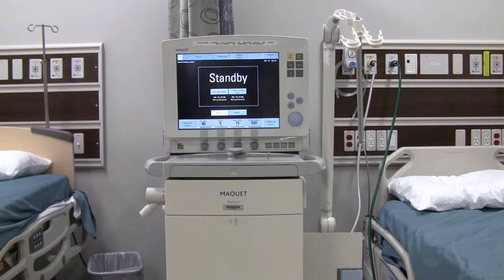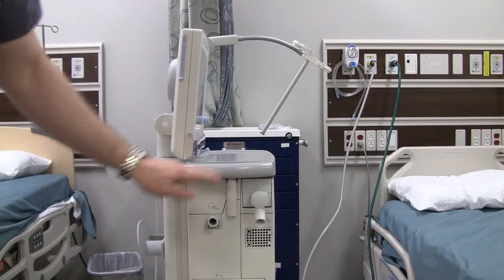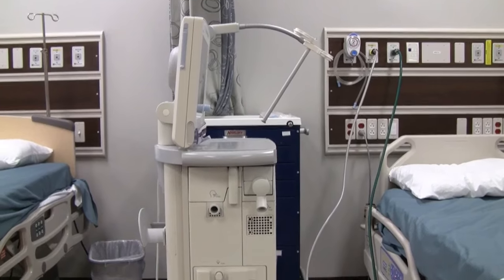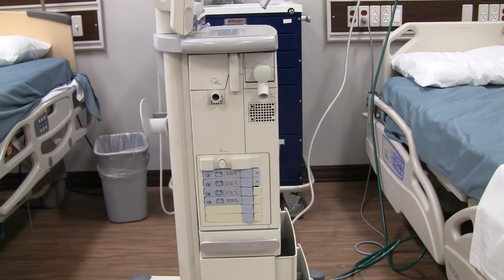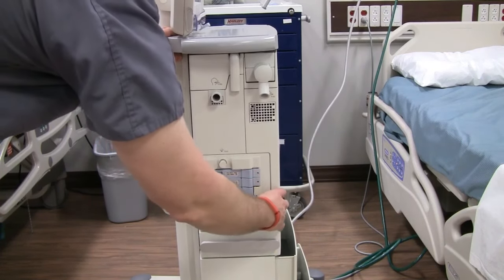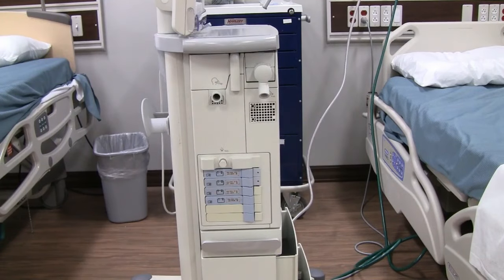Turning the unit to the left side, we can see the inspiratory and expiratory outlets. Below that we also have a battery bank that can hold six different batteries. These can be swapped during ventilation or changed out any time we get an error. To do so, push the battery to the side, push down on it, swap it out, get it back in, and it locks back in place. Simple as that.